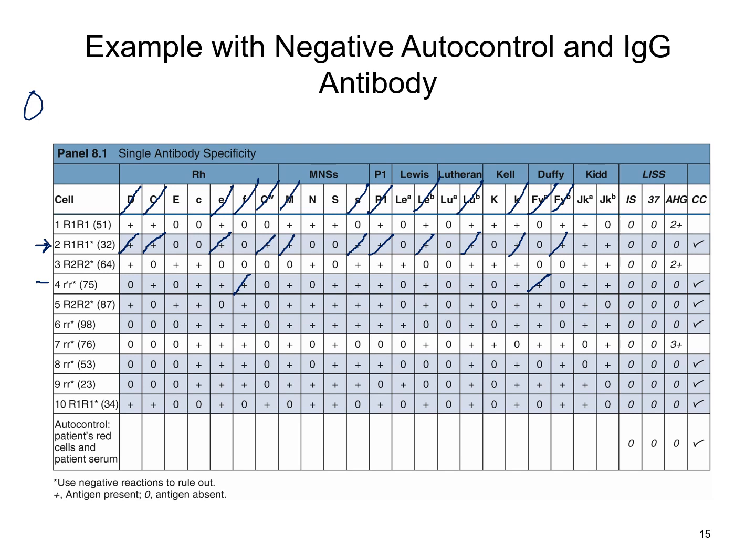Okay, number 5. We've got big E, homozygous big E, so we can rule out here. Moving on, C, homozygous little c. Next, we're going all across to N, so M and N, hetero, cannot use it. Big S is hetero, cannot use it.